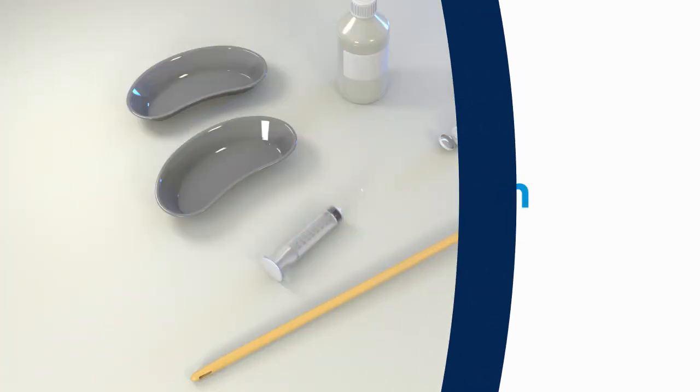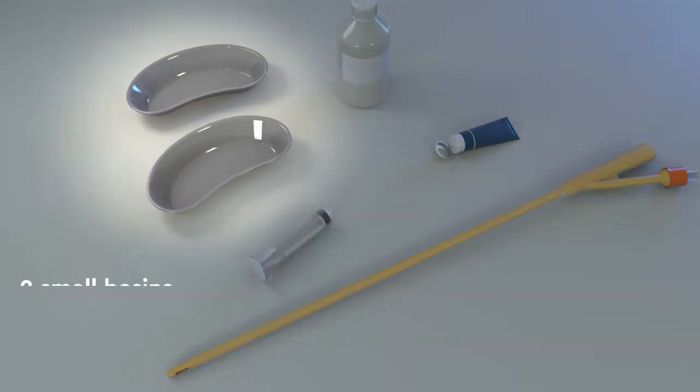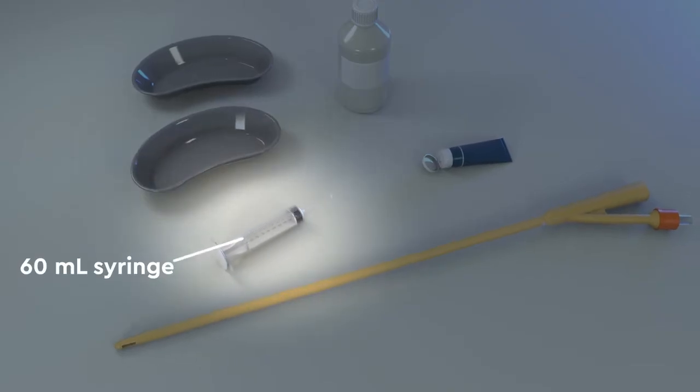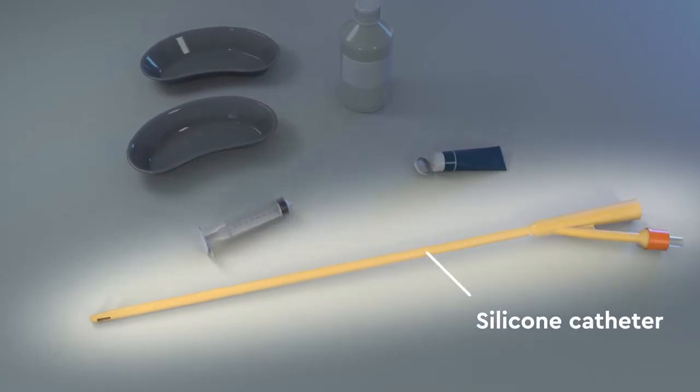You'll need the following supplies in order to perform a rectal irrigation: two small basins, a 60 milliliter syringe with catheter tip, and a silicone catheter.